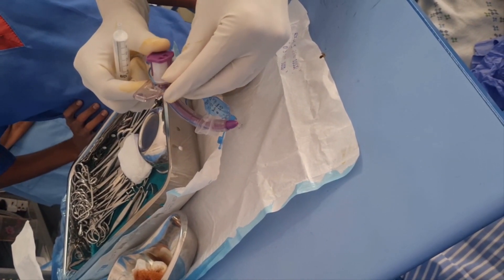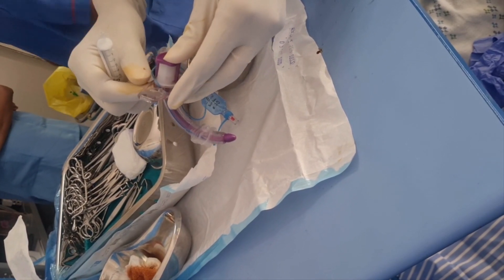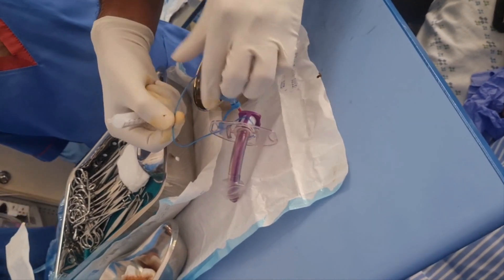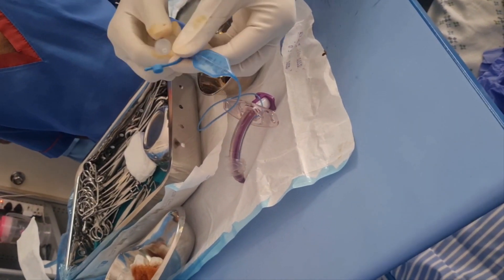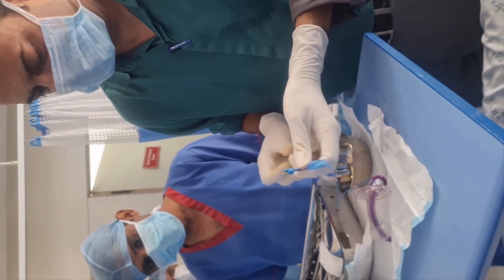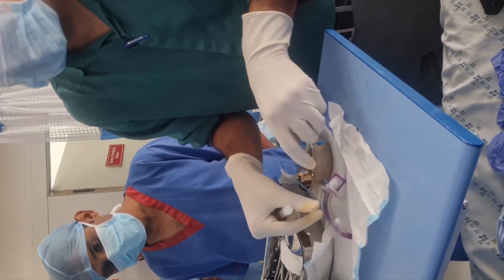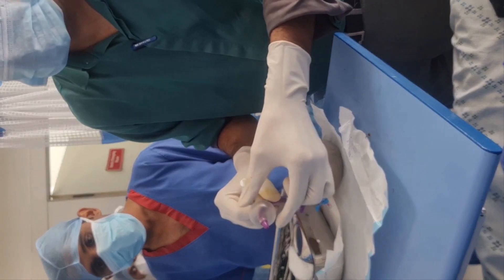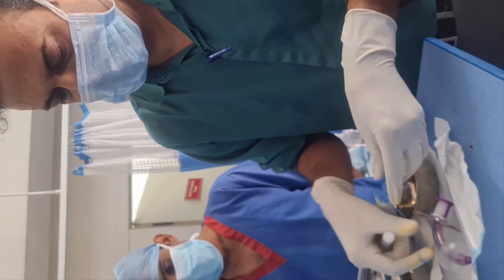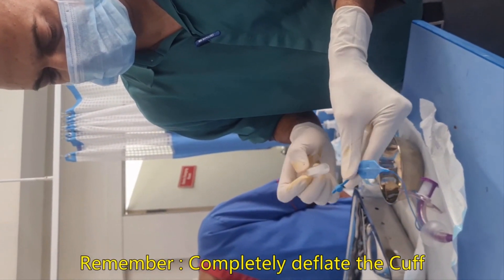The tube to be inserted should ideally be the same size or a lesser size. The present patient has a size eight tracheostomy tube, and we will be changing to another size eight tube. Check the cuff by inserting around 20 ml of air. Here we see the cuff is completely filled with no leakage.